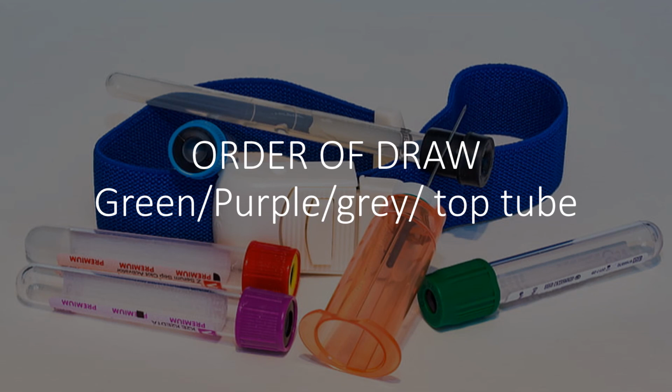Because the gray top tube not only has, it has two different kinds of additives in it, okay? First, it has sodium fluoride. Sodium fluoride is what I refer to as a preservative. It preserves that glucose. So the gray top tube is the best top tube to draw if you're doing glucose, okay? Because it has something in there, it preserves that glucose, so that if that tube sits there for a little bit, you're going to make sure you get that same accurate result in that glucose, because it stops glycolysis.